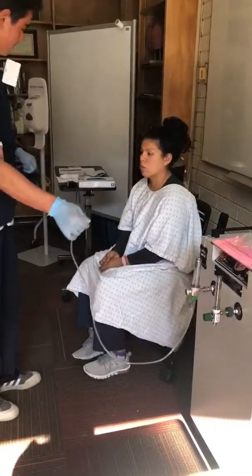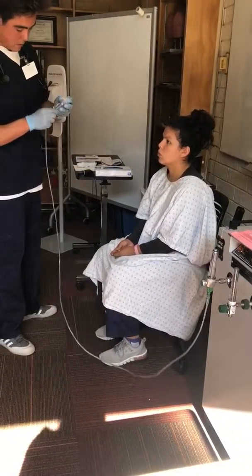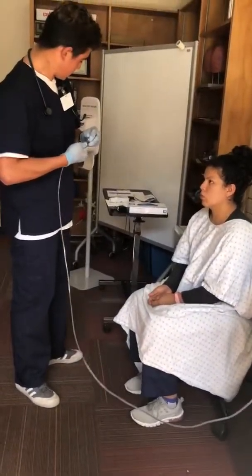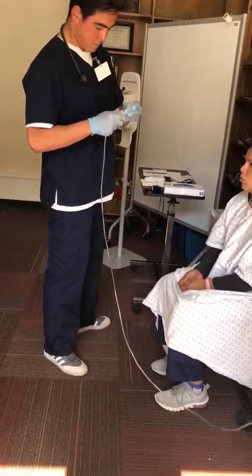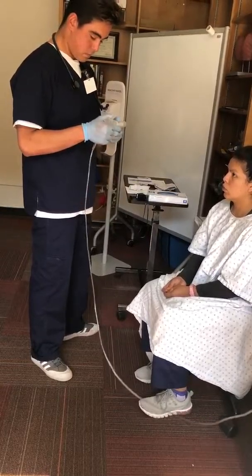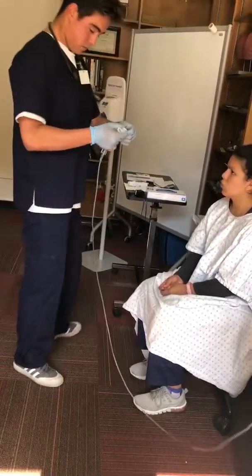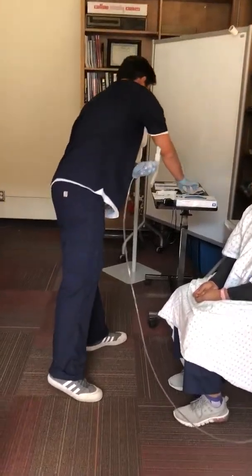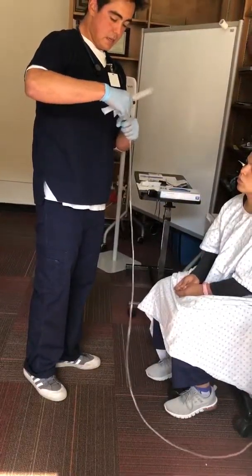Attach our T-tube. Okay, so this is our unit dose of albuterol. We're going to be putting it in the nebulizer.